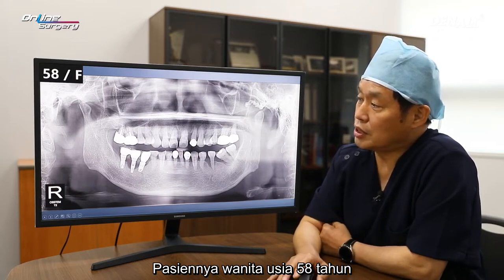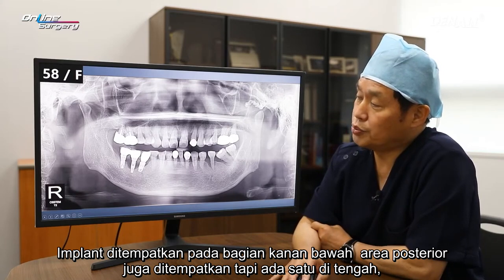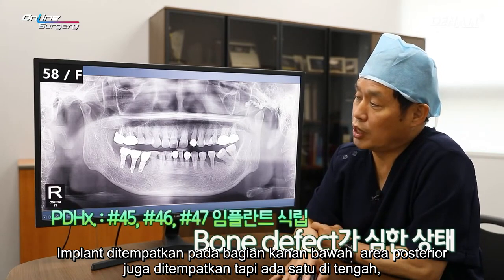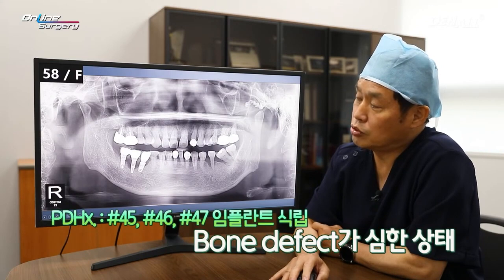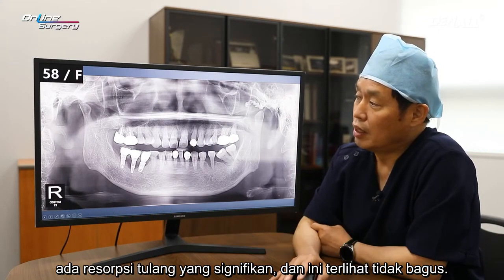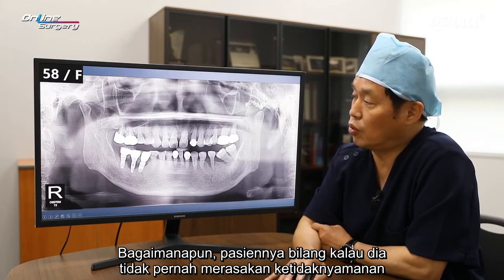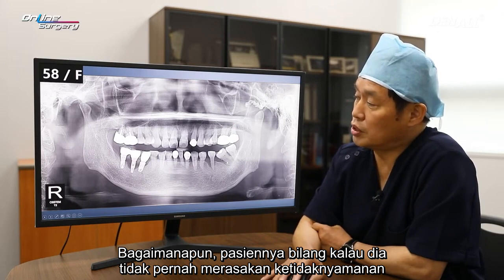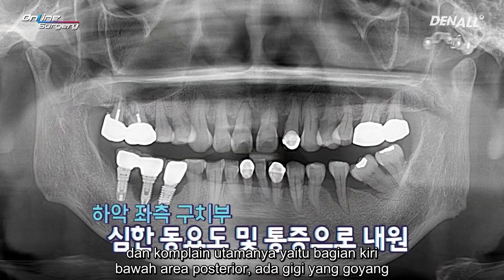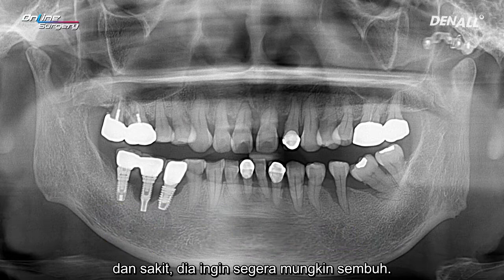58-year-old female patient. Lower right, posterior area, implants are placed, but the one in the middle has a lot of bone resorption and it doesn't look very good. However, the patient says she's not facing any major discomfort and her chief complaint is the lower left posterior area. There's a lot of mobility and pain and she wanted to solve this.